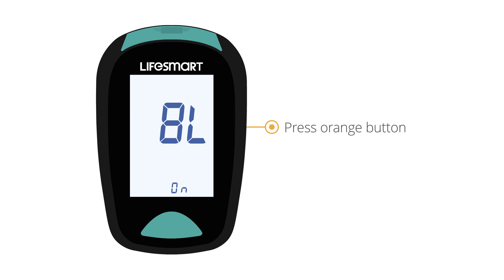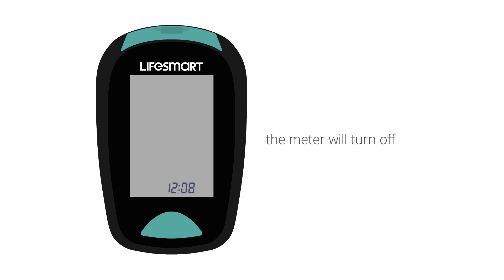Press the orange button one last time and the meter will turn off. These settings will remain in the meter even if the batteries are changed. The meter can hold 1000 readings and is now ready to use.